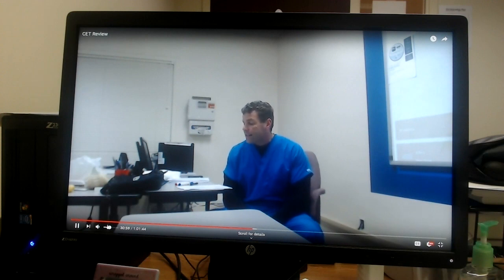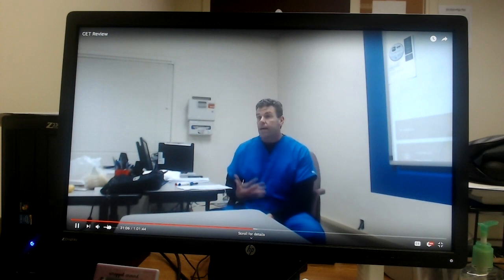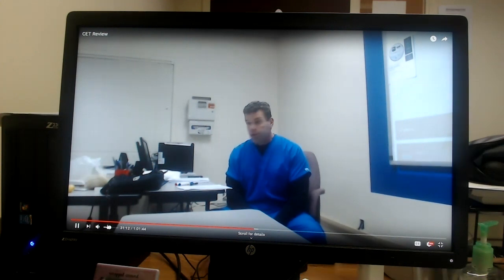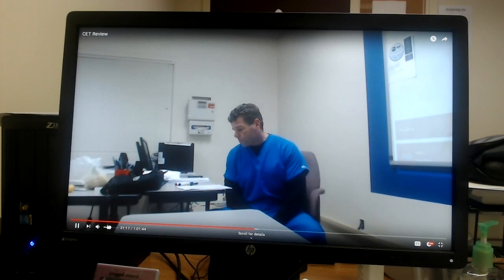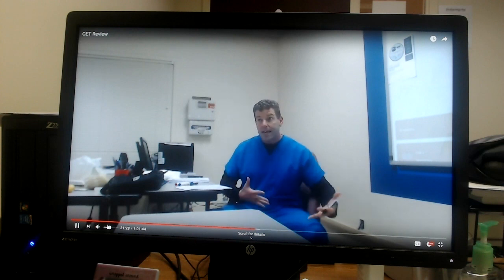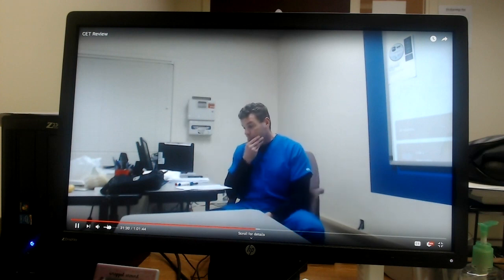Document only unusual activities. No, document everything that you do throughout the course of the day. But if you feel something odd when you're going to the restroom or when you're eating or when you walk up a flight of stairs, then definitely document that too. There are no hygiene restrictions. Oh yeah, there are. You can't get in the shower. You can't take a bath. And monitor the heart only during exercise. No, you're not exercising for a whole 24 hours. They want this monitor to monitor everything you do in 24 hours. Sleep, eat, go to the restroom, whatever.